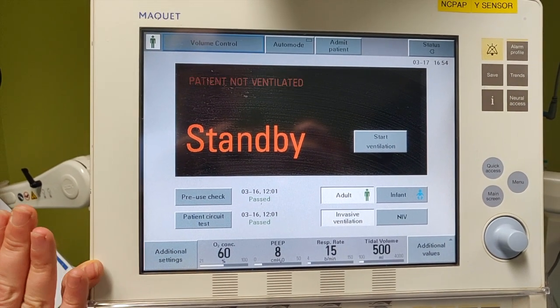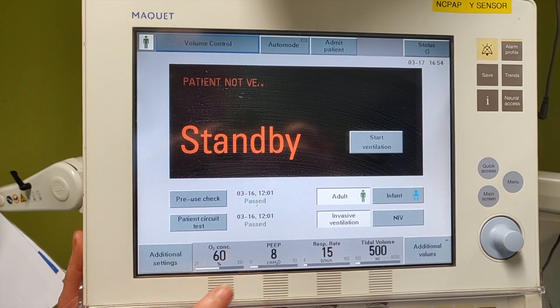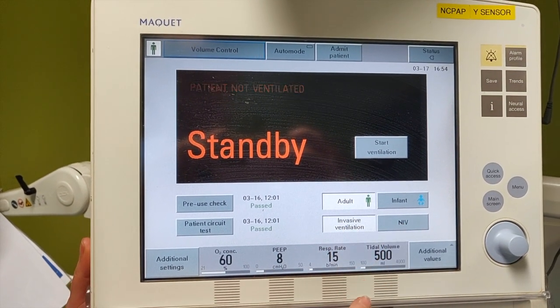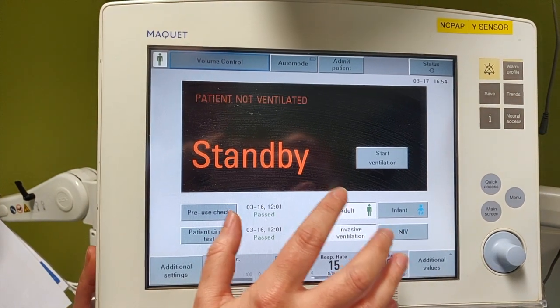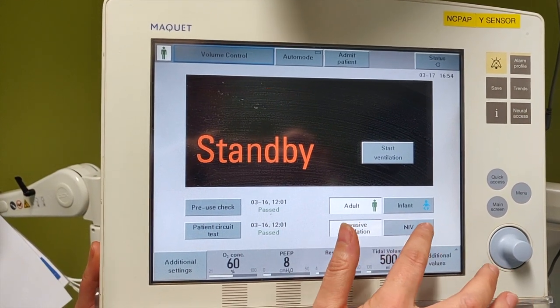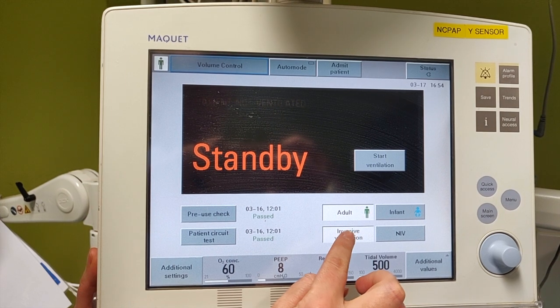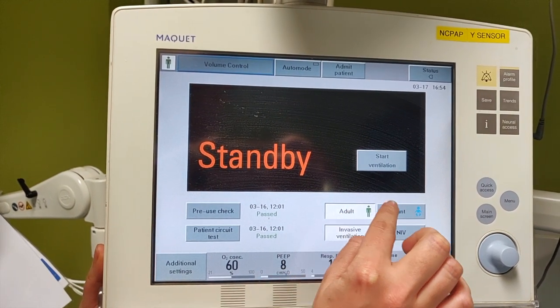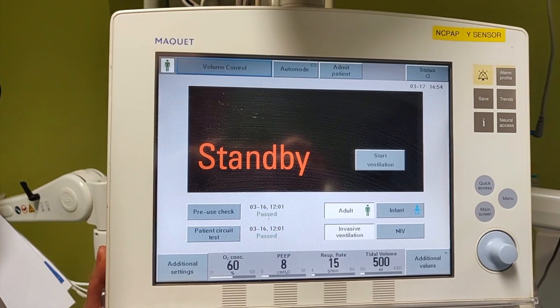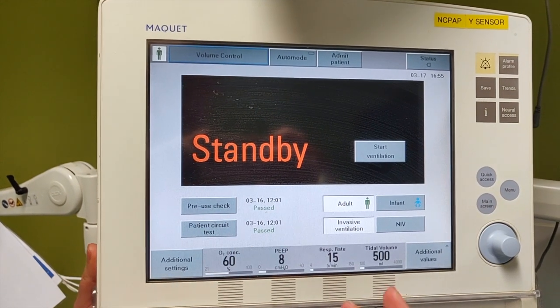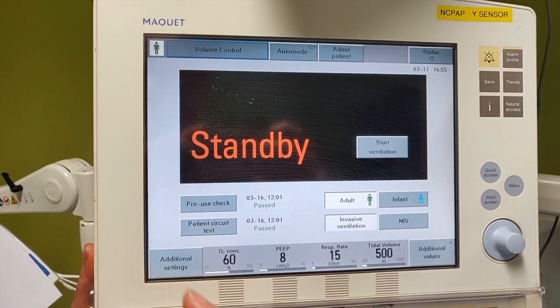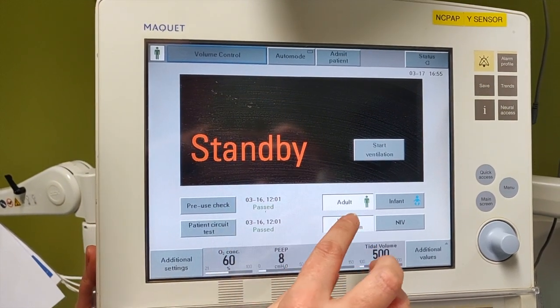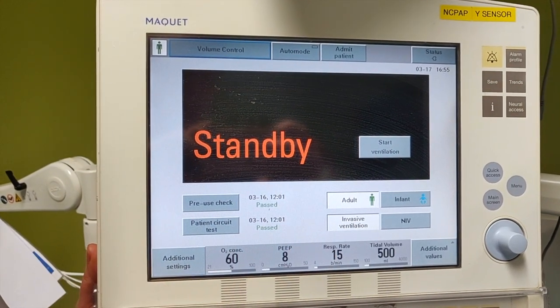The first thing we see when we look at the ventilator is that we're going to have to choose between invasive and non-invasive ventilation. This is because this ventilator in particular has a non-invasive module. So we're going to choose invasive ventilation. Some ventilators also change how they work depending on whether you're going to ventilate a small or big patient, changing how much gas circulates and some of the settings. So we're going to set up adult.